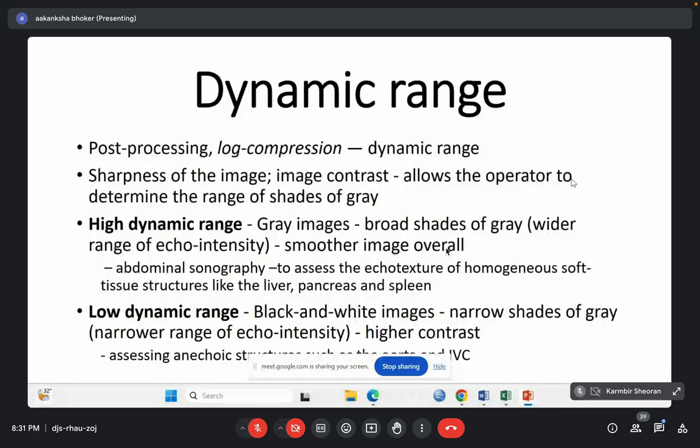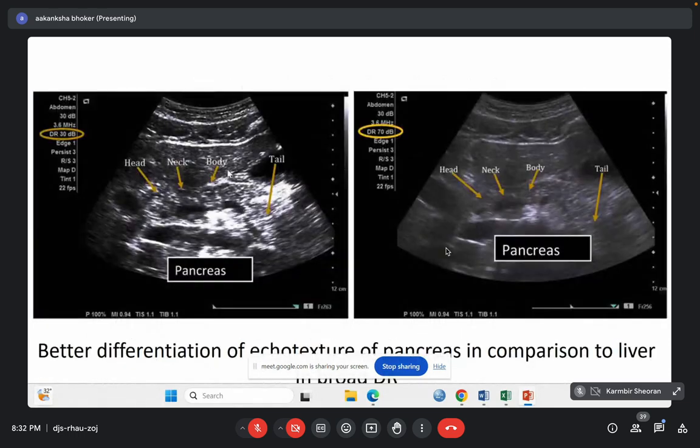Next is the dynamic range. Dynamic range का क्या मतलब है? Image के through we will understand. Dynamic range, it affects the sharpness. Suppose this is an organ, this is pancreas, this is the lobe of pancreas, these are the vessels, head, neck. So in this we can identify all the structures very beautifully. We can demarcate. Whereas in this, either the things are very dark or the things are very bright.